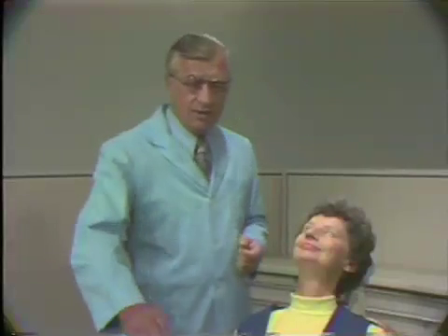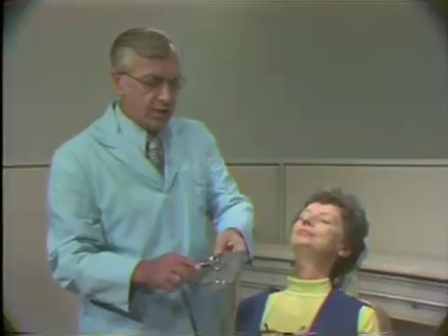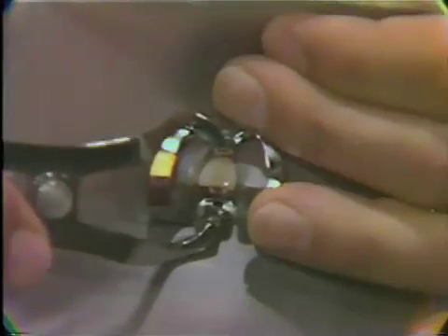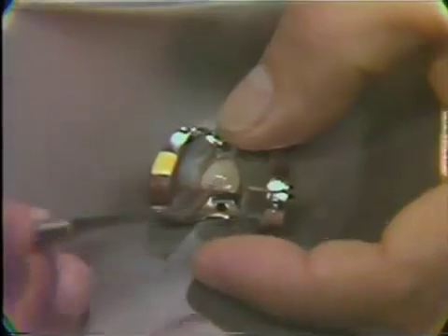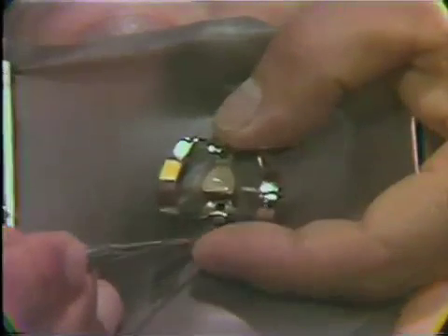We will demonstrate the placement of the rubber dam on the maxillary right central of this patient. The rubber dam clamp forceps are placed in the holes of the rubber dam clamp, transported to the maxillary right central. The wings of the clamp are spread apart with the rubber dam clamp forceps, and the clamp is placed touching the enamel surfaces of the maxillary right central down to the cervical. The rubber dam clamp forceps are removed. With a plastic instrument, the rubber dam is removed from the wings of the clamp so that the rubber dam completely isolates the tooth at the cervical.